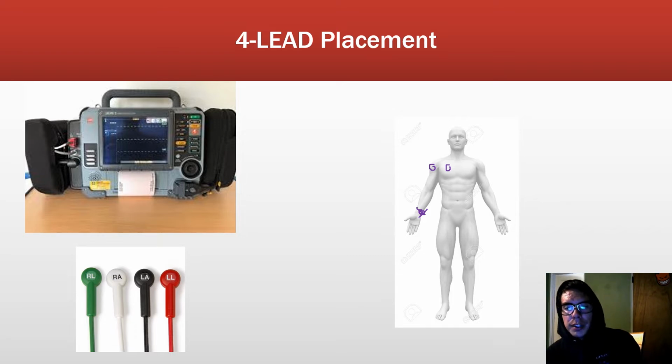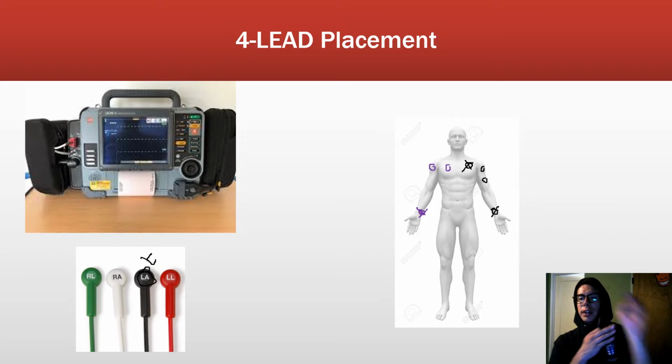So then the left arm, the smoke, black one. Again, now we're talking about that one. Oh, it's supposed to be an arrow. This one. Same thing. You can go there, or the next most common spot is there, but it can also go there, or there, if you want it to. But this one and this one are the main ones. So there or there.